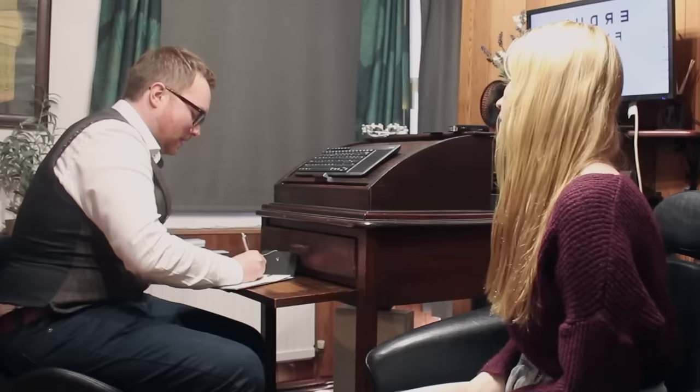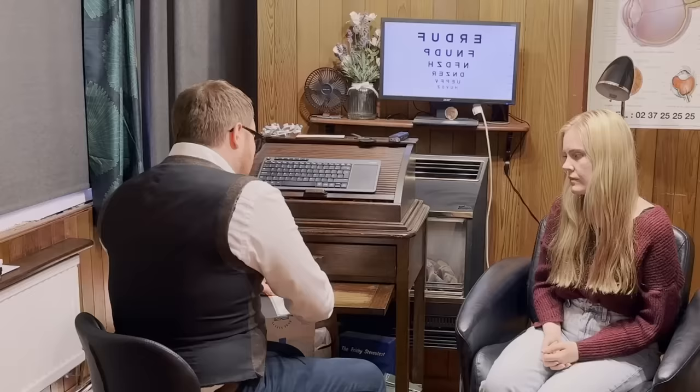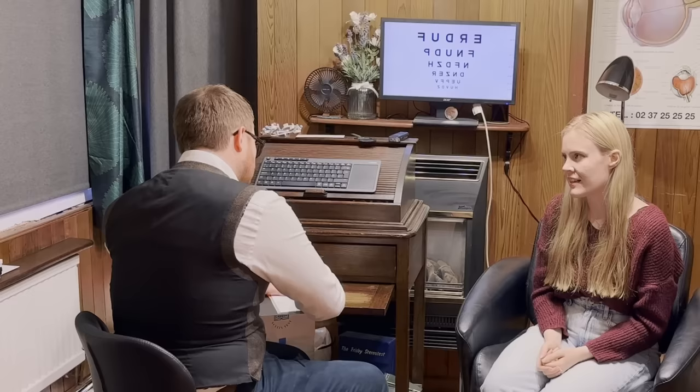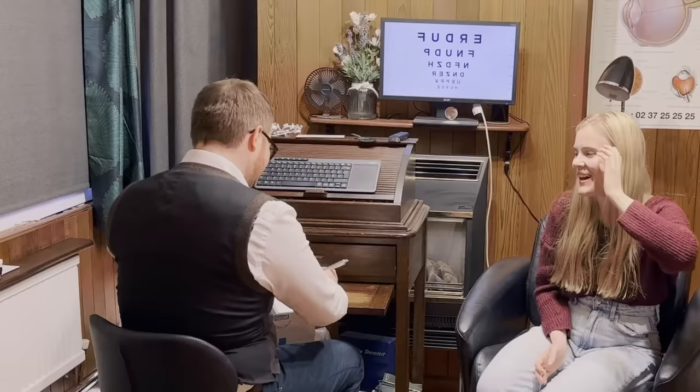Okay, and these glasses, how old are they roughly? More than 2 years, probably about 2.5. And how often are you wearing them at the moment? Probably not often enough. Maybe when I watch television in the evenings, I put them on because it's quite far from where I sit. So it's more as and when, as opposed to putting them on first thing in the morning and keeping them on all day. That's absolutely fine. I should wear them more because I can't really read the train times at the station. That could be a bit tricky.